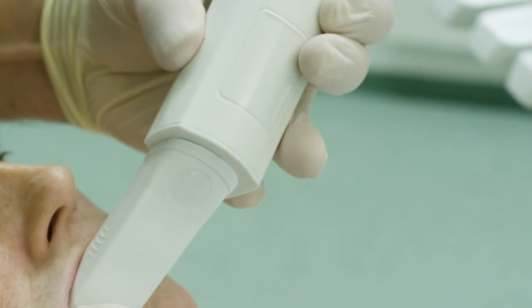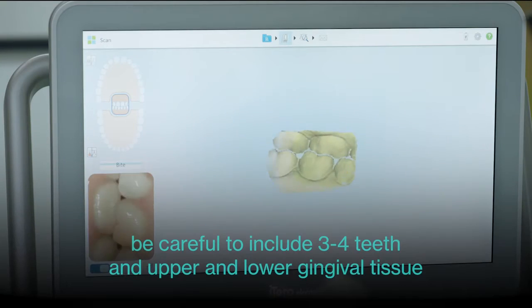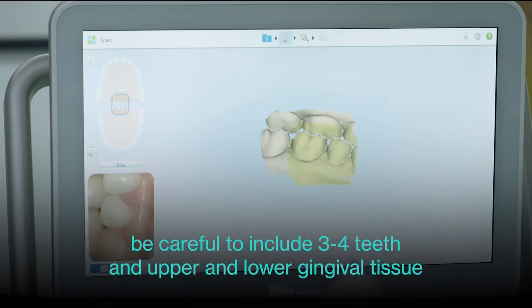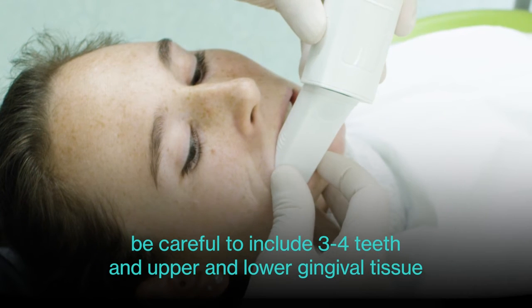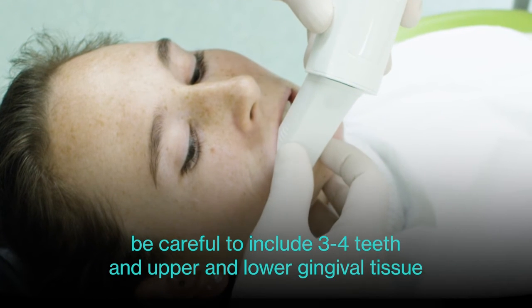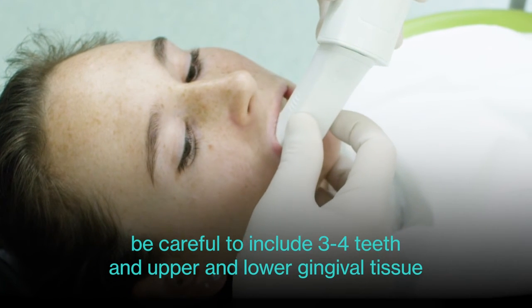Next, press the side button to start the scanner and in a wave-like motion move anteriorly, capturing three to four teeth and the upper and lower gingiva.